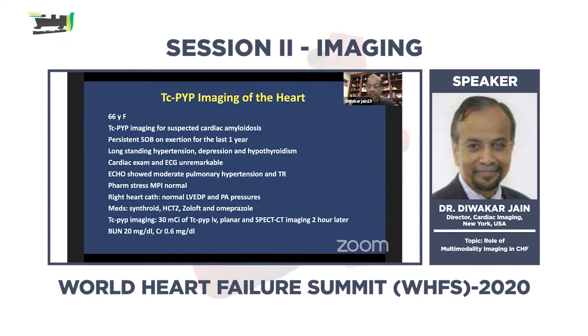Regarding some of these modalities, again, it's very hard to cover them in detail. I will focus on one aspect, which is technetium pyrophosphate imaging for the detection of amyloid.